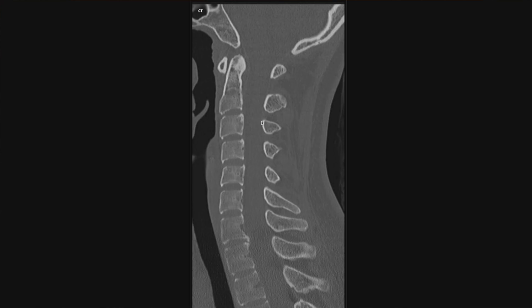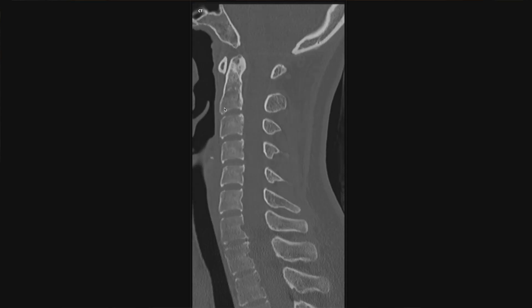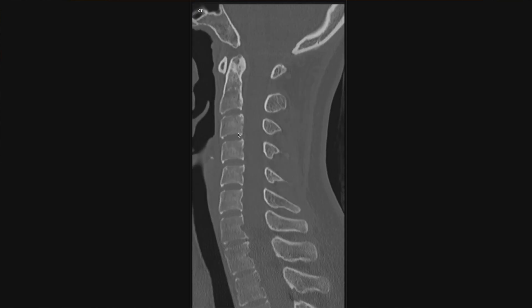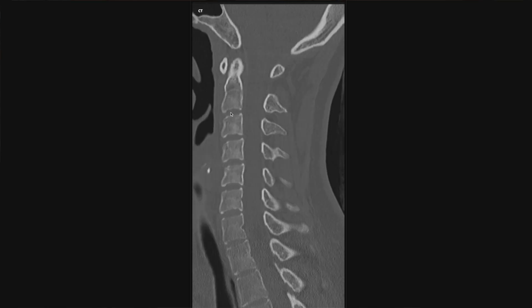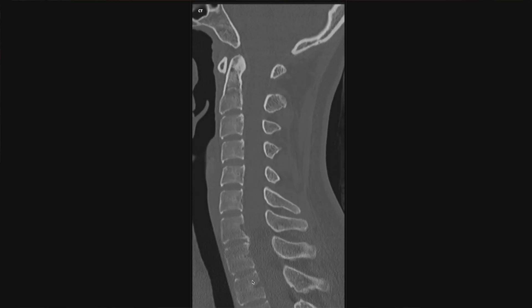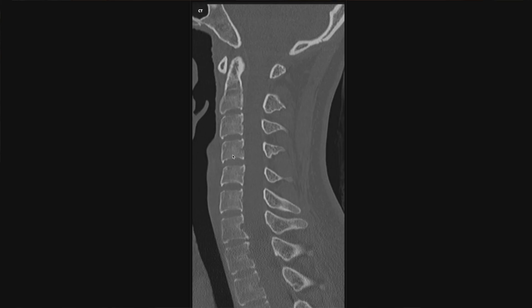Then I go back to the sagittal. I take another look at the dens, make sure it's not fractured and that everything looks okay within C2. In this case, everything looks normal. I take a second to look at the vertebral body heights of each vertebra in the cervical spine — you catch some of the thoracic spine too. I want to make sure that these vertebral heights are normal, and in this case they are. I don't see any fracture lines. The sagittal is a good plane to look at vertebral body height.